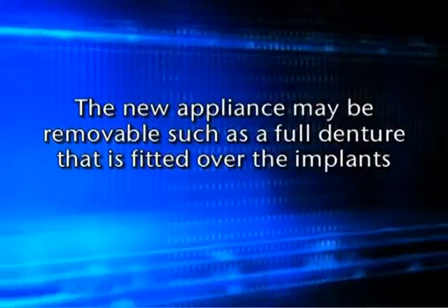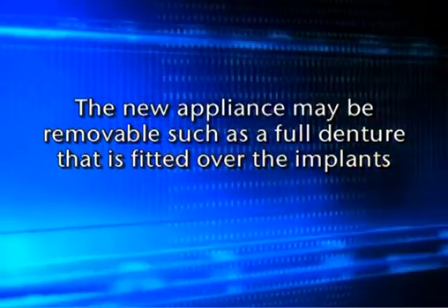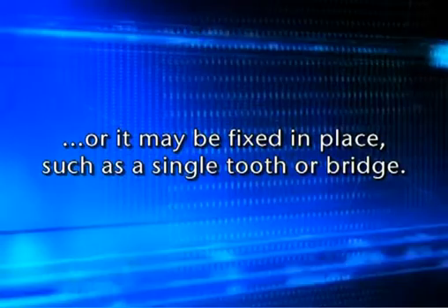The new appliance may be removable, such as a full denture that is fitted over the implants, or it can be fixed in place, such as a single tooth or bridge. The decision to create a removable or fixed dental appliance is determined on a case-by-case basis, depending on factors such as the number of teeth to be replaced.